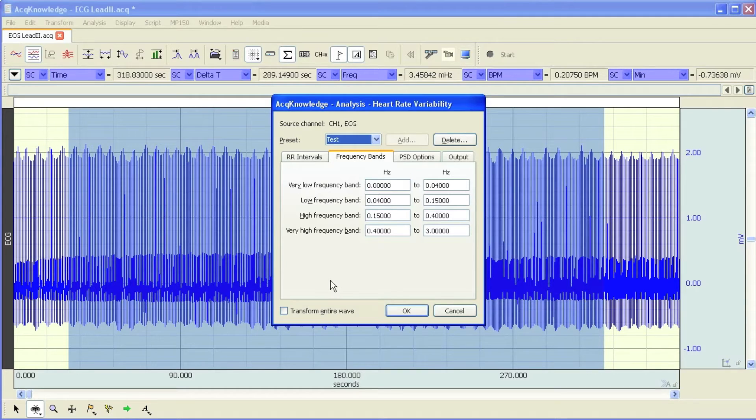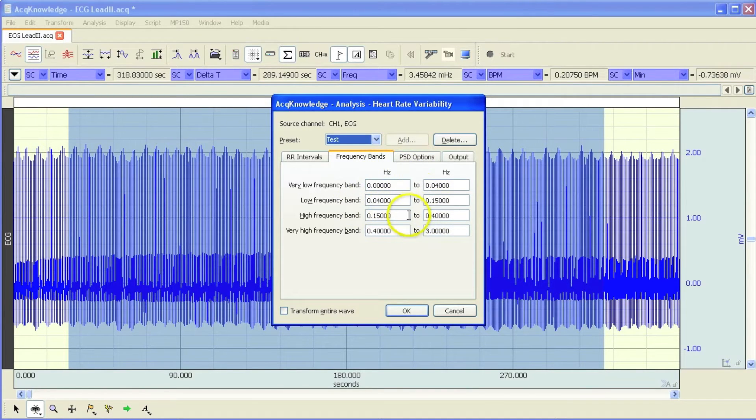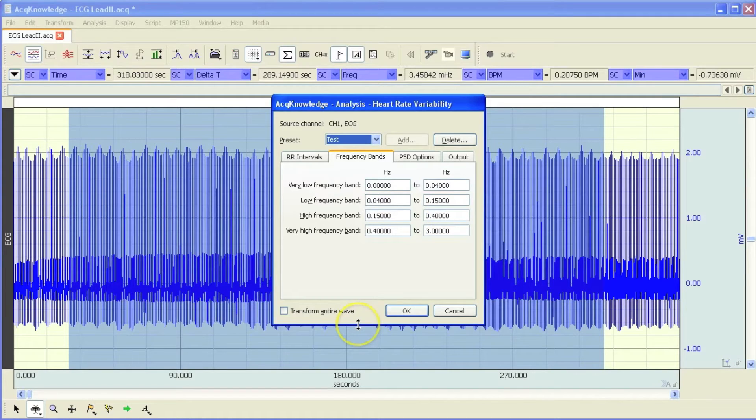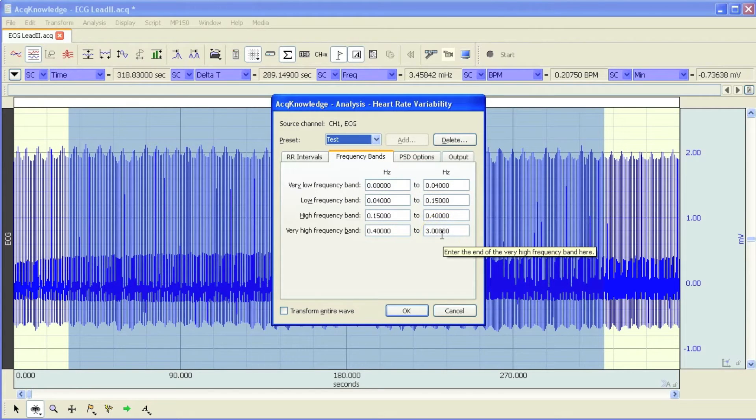And this particular HRV algorithm meets the standards that were, or the frequency domain algorithm standards, as published by the European Heart Journal. But it is possible to modify these if you're trying to compare results from a published paper, and maybe they've used different settings. You can come in here and set these to slightly wider or narrower bands.